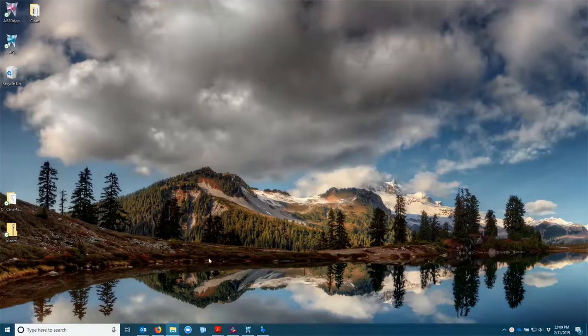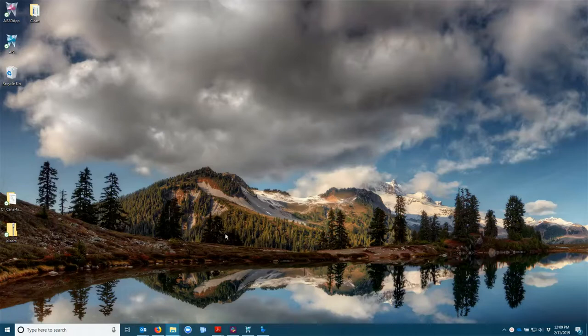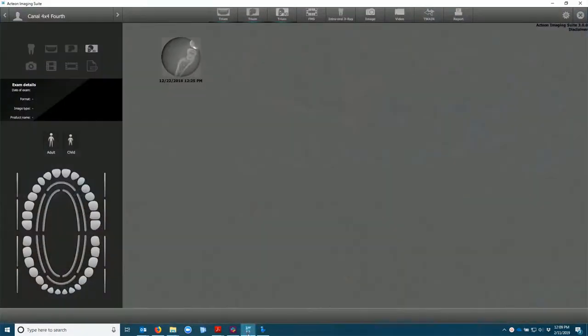This is how we import a DICOM scan into AIS. We have AIS running.